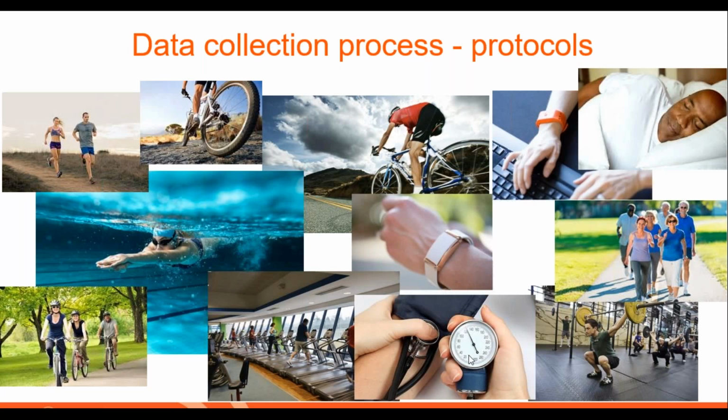Talked a little bit about protocols, but you've got to think about them and your use case. You just can't sit at the desk or go walk around the parking lot and say, wham, bam, I've got a biometric sensor that works. You've got to test. We ask anyone, even media reviewing anything, to test with at least 3 people. In our lab, we try to test with 20 different people on every variant of every device that we have. Once you get to 20, then you can start to really make some decisions. If you try to start making decisions early at n equals 1 or n equals 3, to some extent, you can be led down the wrong path.